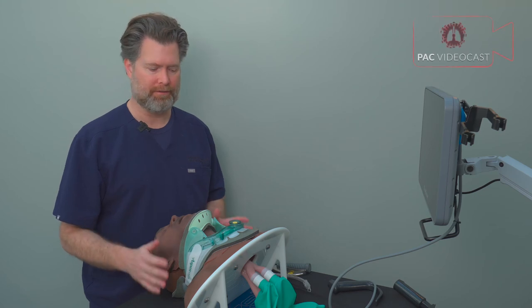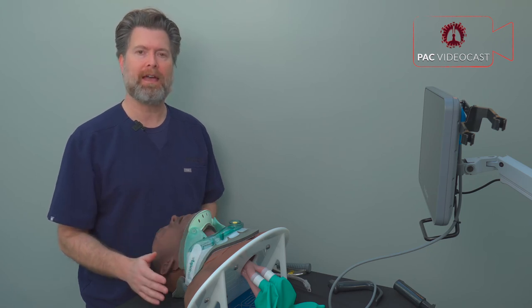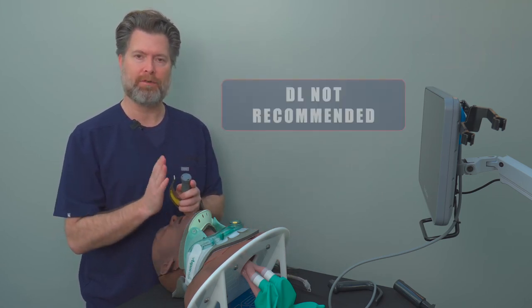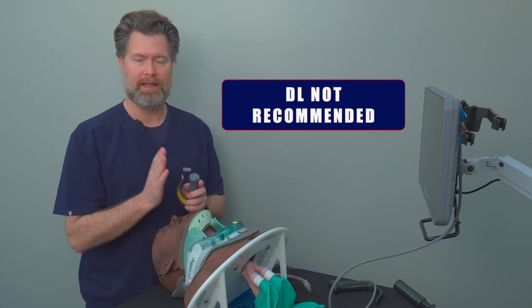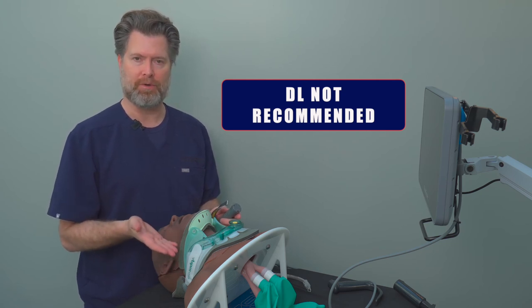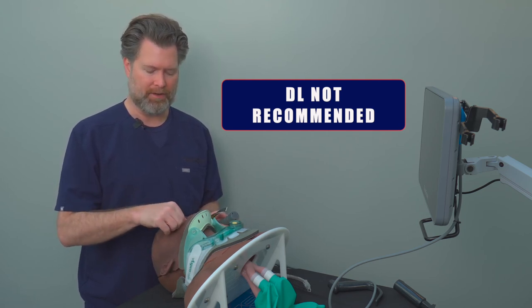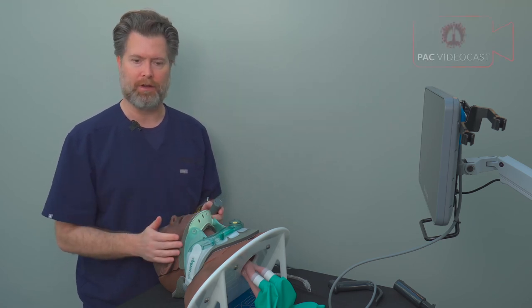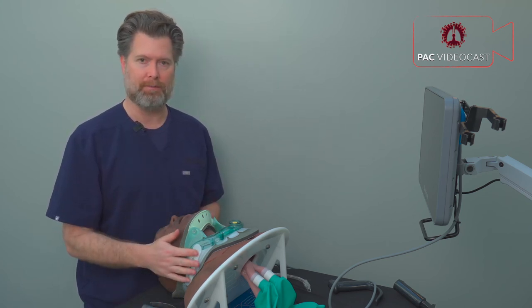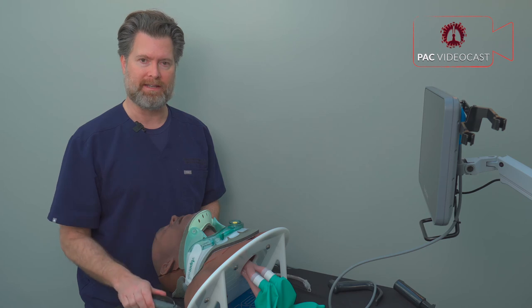To summarize: it is possible to intubate a patient with cervical spine injury with a cervical collar in place without manual inline stabilization. However, the direct laryngoscope doesn't work as well as the video laryngoscope here, because you must keep the patient in the neutral position — you can't use the ear-to-sternal-notch position — making views harder. The restricted mouth opening further prevents a great view to the glottic opening. If all you have is a direct laryngoscope, use manual inline stabilization.